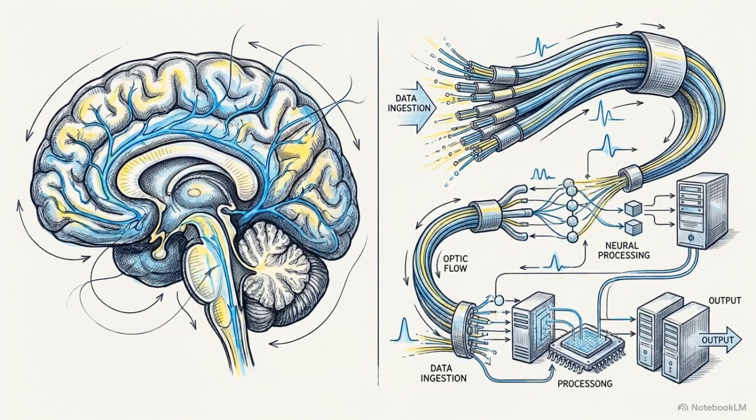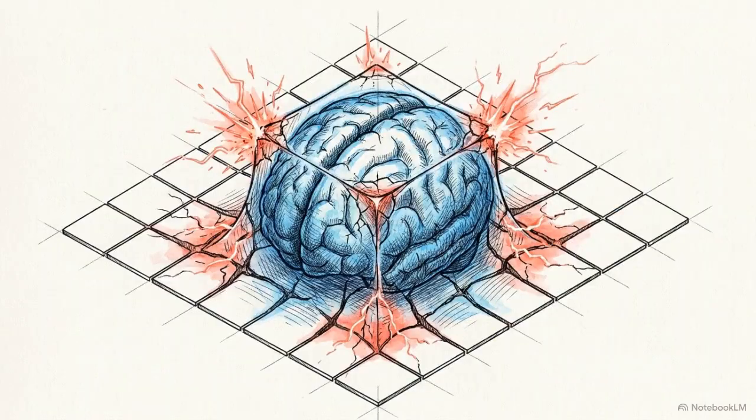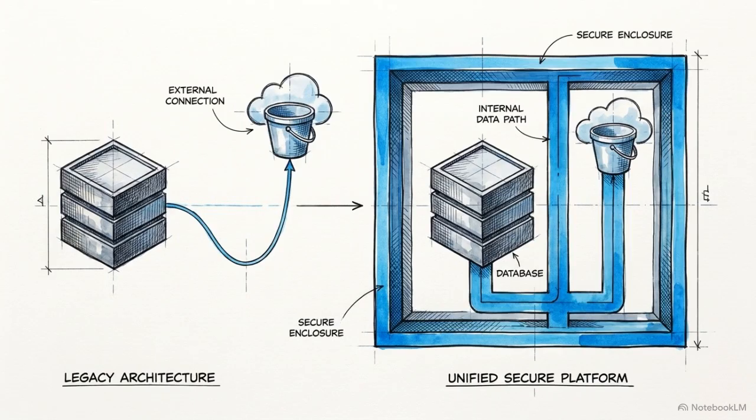Medical infrastructure needs an architecture capable of supporting massive binary weight while maintaining relational lookup speed. Treating a high-resolution MRI as a simple table entry degrades the entire database's performance. General web development often uses external file references, storing a URL pointer in the database while the file lives on a separate content delivery network.